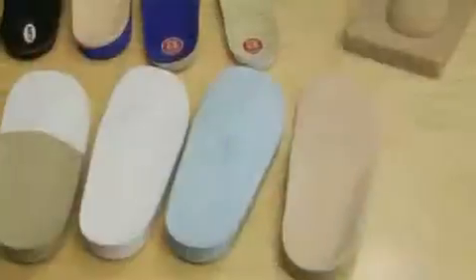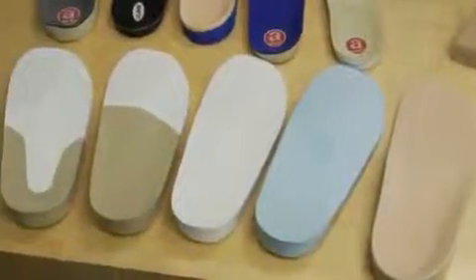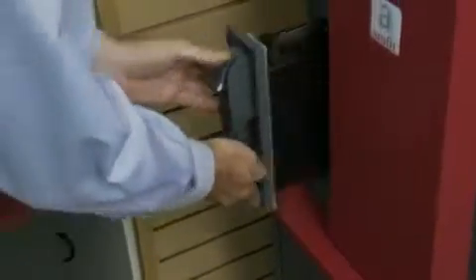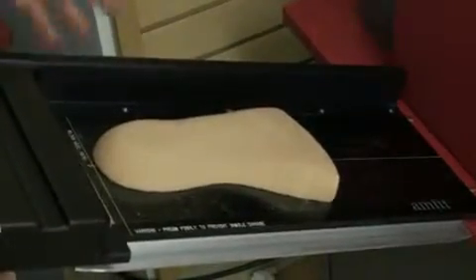Then just select from six densities of Amfit's EVA blanks available in a wide range of sizes. Your mill grinds out each EVA blank in less than 10 minutes per foot, or mill out a positive model of the foot to vacuum form materials such as carbon fiber or polypropylene.